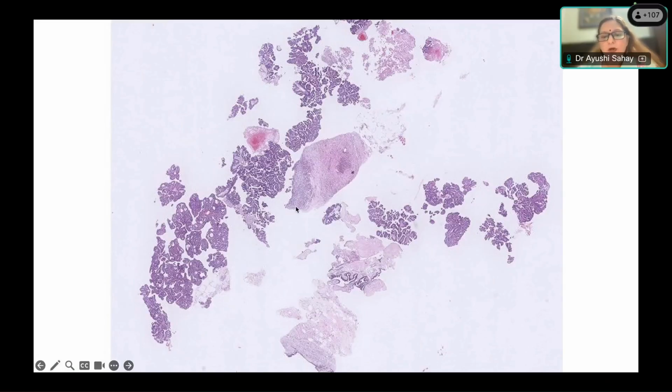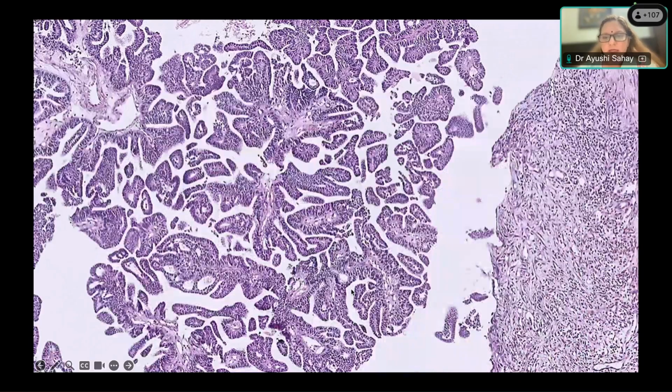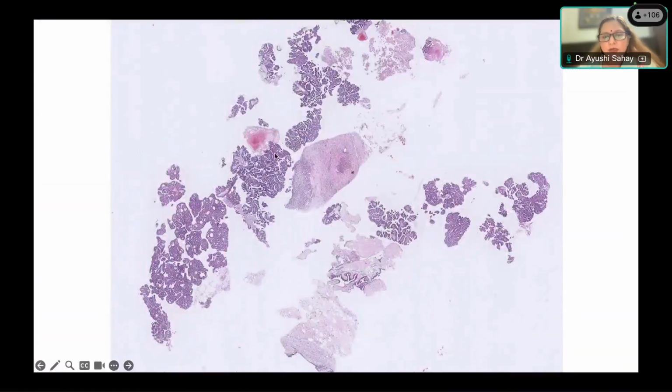And this is very important for the further classification of papillary neoplasm, that you are having not just the cores, you are having the periphery of the lesion. And you have to look for any kind of invasion you are seeing in the periphery, beyond what you are having inside, which is the intraluminal papillary fronds. But inside in the wall of the lesion at the periphery, are you having any cells, are you having any invasive tumor? So that also you have to look for.